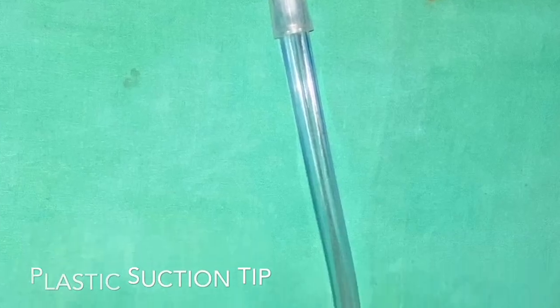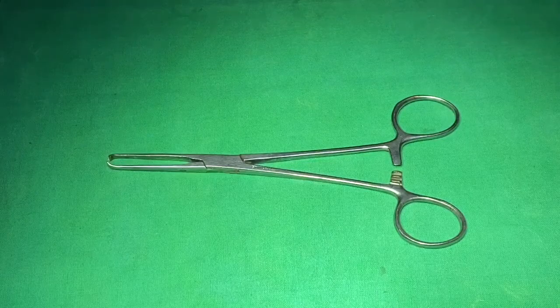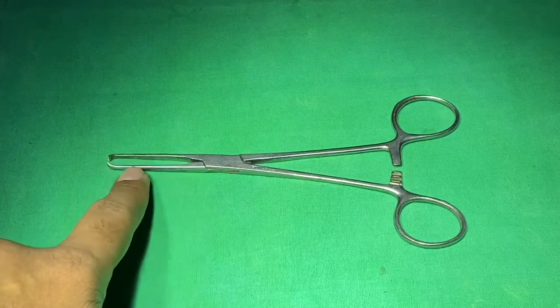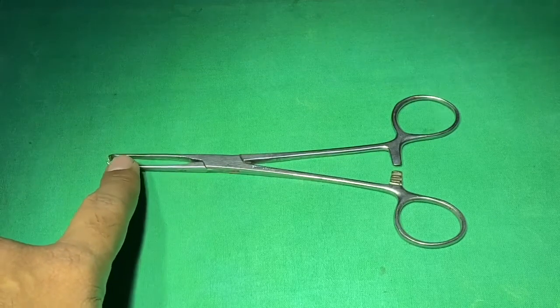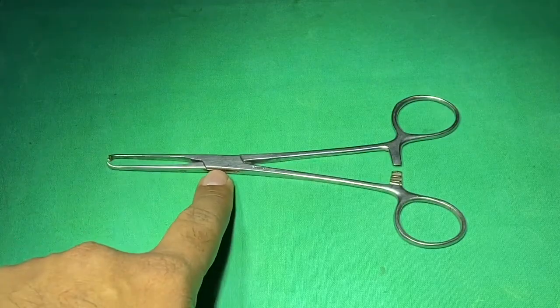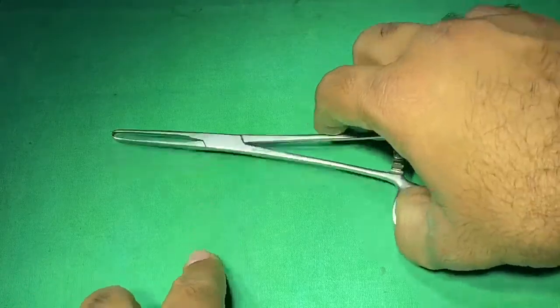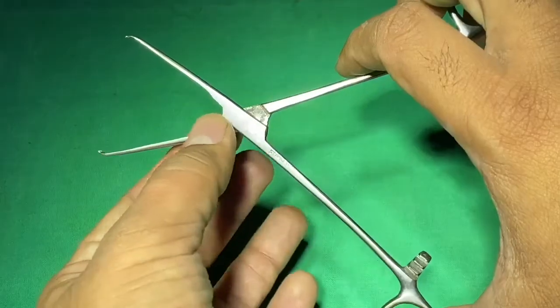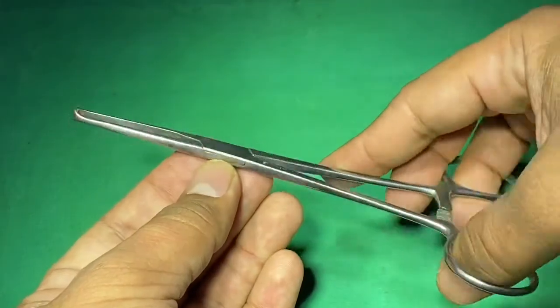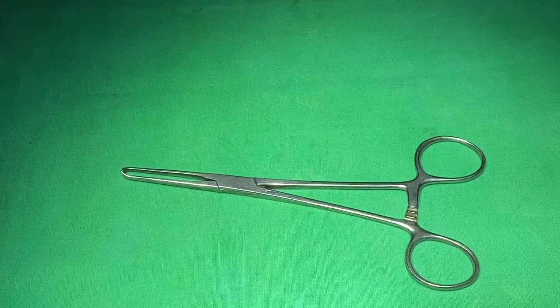This is an Alice forceps. You can see the jaw of the instrument and the fulcrum — the joint of the instrument. As mentioned earlier, this is a box kind of fulcrum; you can see both shafts are joined with a box kind of joining, hence the name box joint.